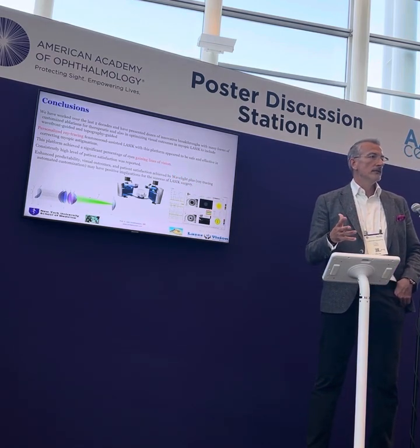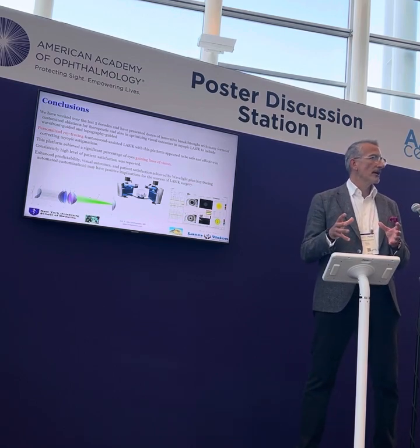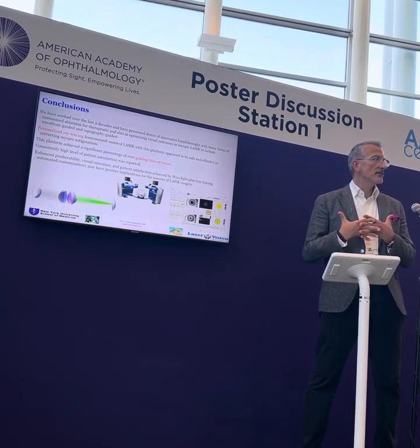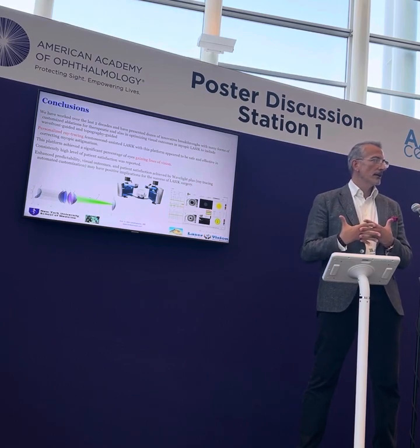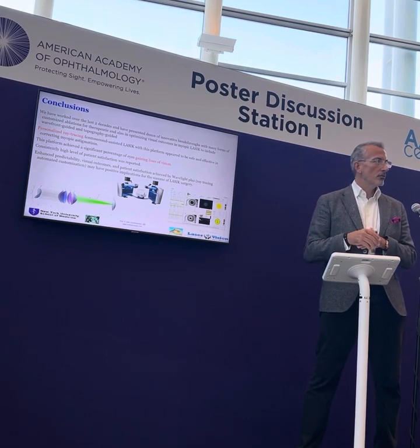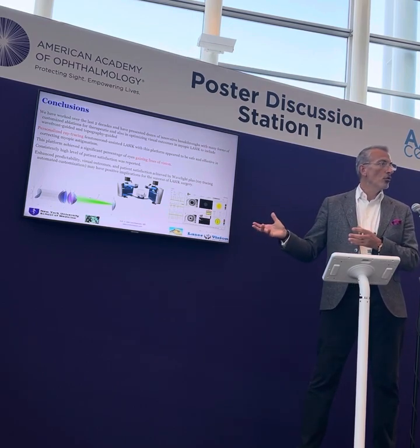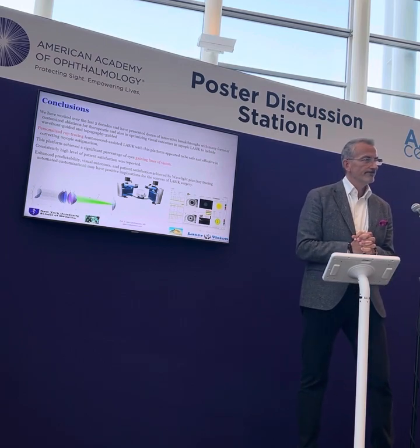In reality, in the real world, since 2019, we've changed the optotypes in our center to be able to look into the 25 visual acuity, which is something I have never, ever had to do in my life. So we have all the optotypes in our center in Athens now. 14 optotypes have been upgraded to be able to look at lines of vision that we never evaluated before. I want to thank my co-investigators in this study, and of course you for your attention. Thanks so much.